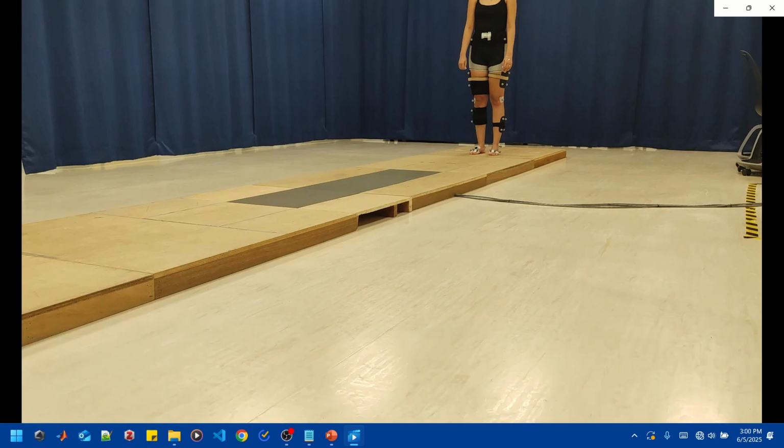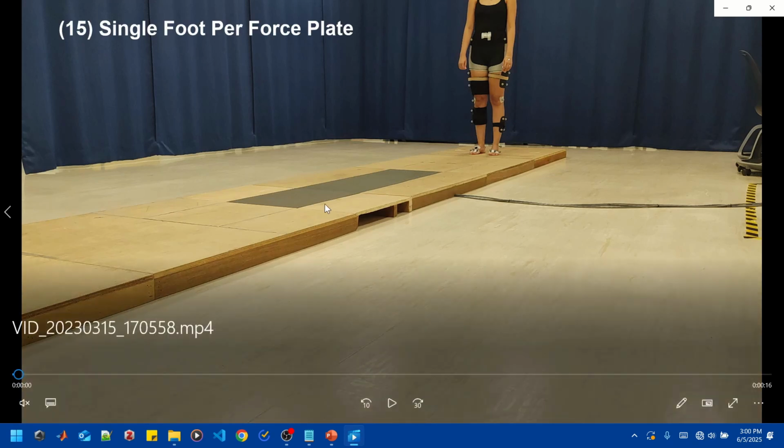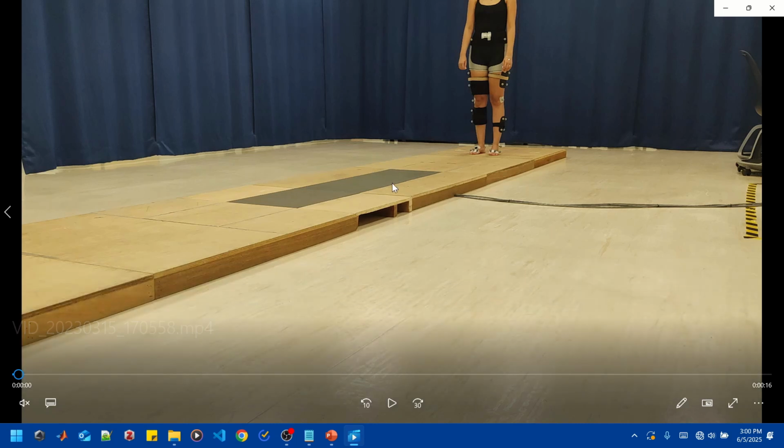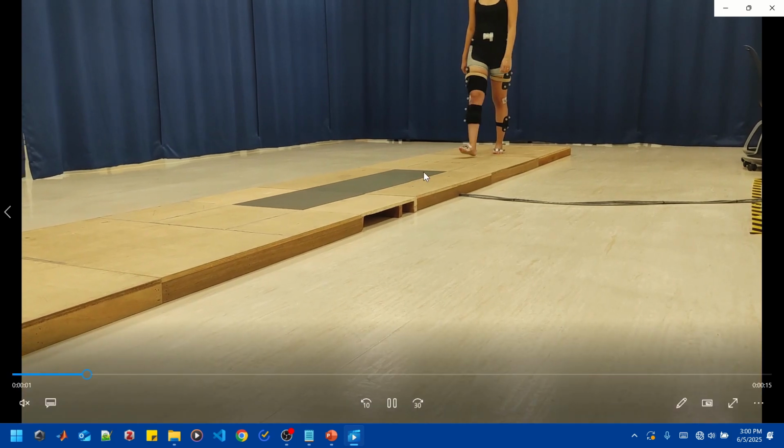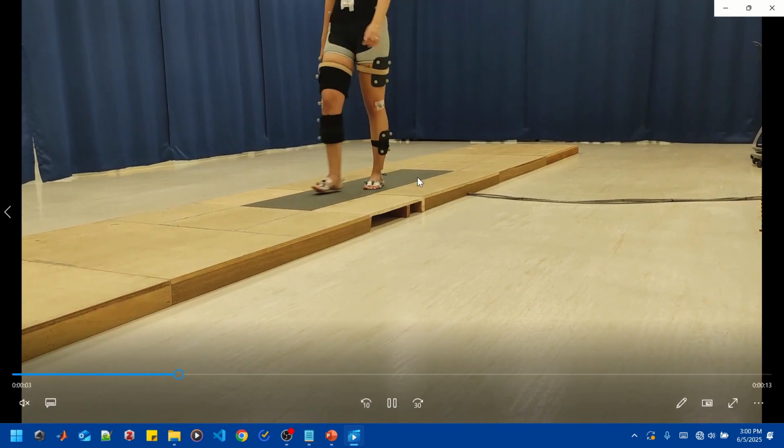Tip number 15 is if you are using force plates, you must instruct your subjects to keep one foot on each plate. If a subject places their foot on the crossing between two plates, then their ground reaction force will be picked up by both plates, which will give an incorrect reading. So when walking, subjects should keep one foot on exactly one plate.